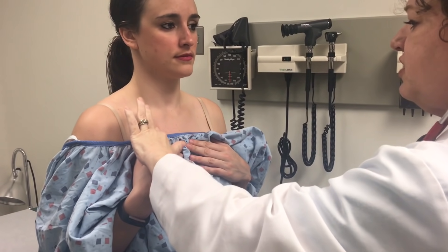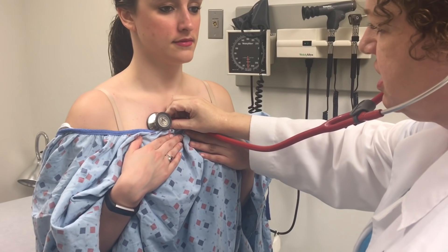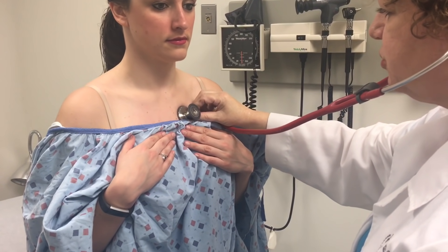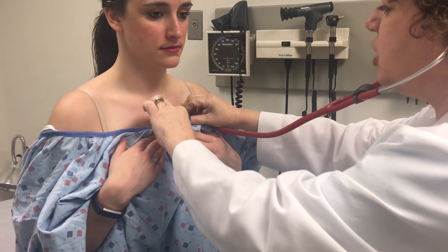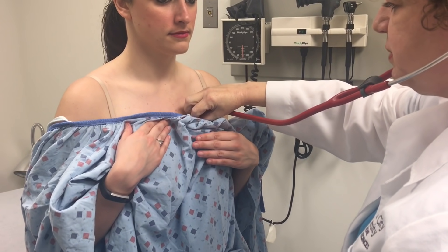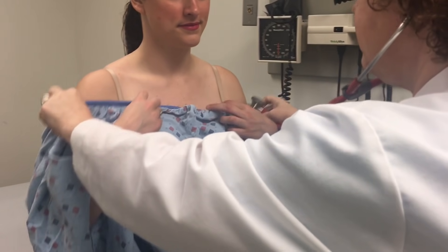Clavicle, first intercostal space, second intercostal space — listening to the aortic valve. Then I listen to the pulmonic valve directly opposite that. I need to lower the gown just a little bit for the tricuspid valve at the fourth intercostal space. Now you can put the gown back up.